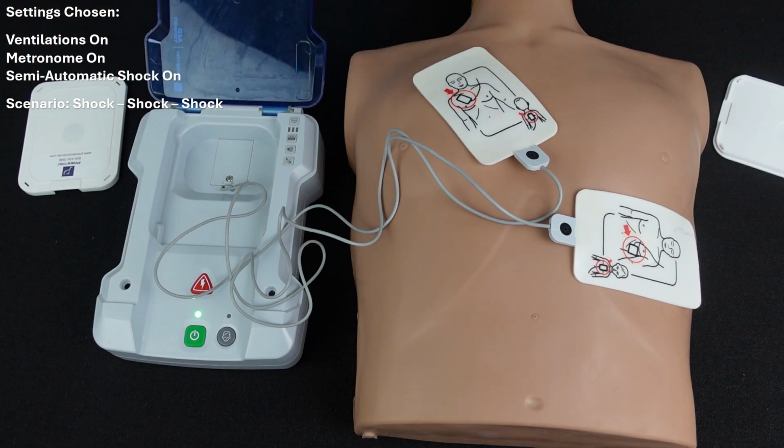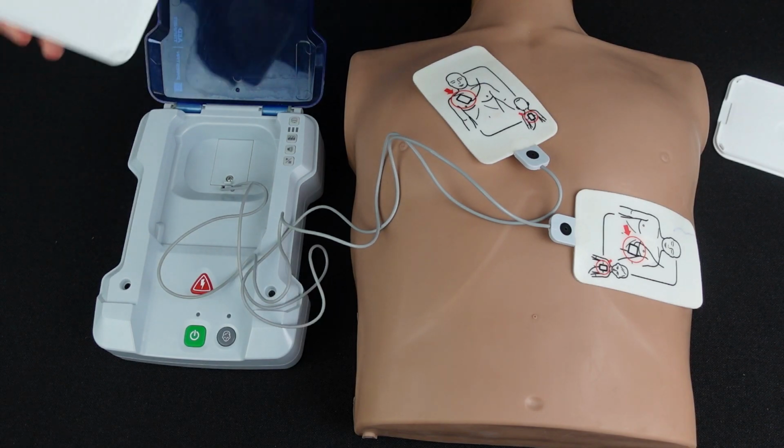Each AED cycle lasts for 2 minutes. After 2 minutes, the trainer will reanalyze the patient for a shock, then move on to the next 2-minute cycle. The trainer will continue going through the chosen scenario on repeat until it is eventually turned off.